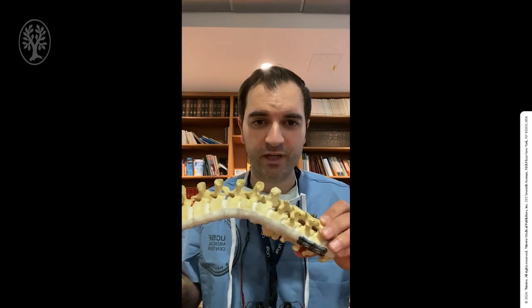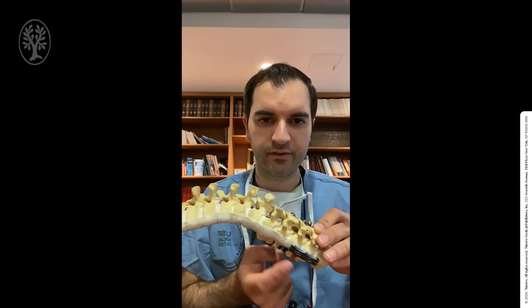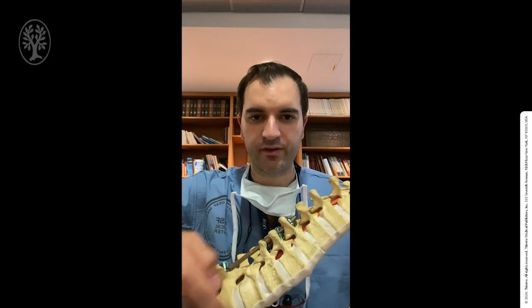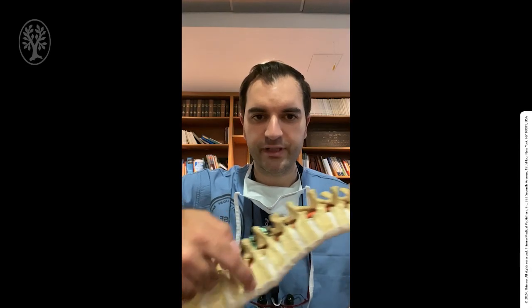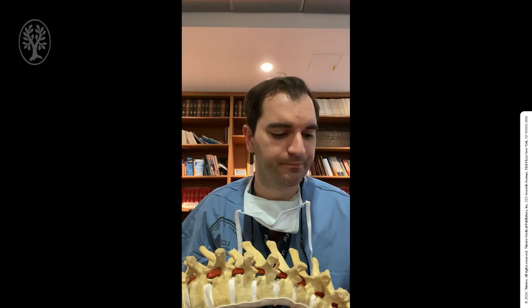If you approach the spine from an anterior aspect, as we see here in the cervical spine, the screws were placed into the vertebrae. We can also do the same in the lumbar spine, and we can place them laterally as well if needed. There are other anchors we can choose. We can choose hooks, and we can choose wires. These can be placed around the lamina, around the pedicles, around the transverse processes, and even around the spinous processes.